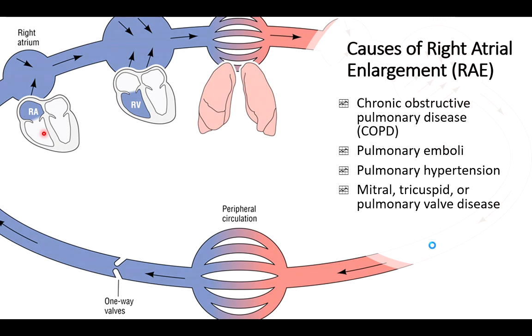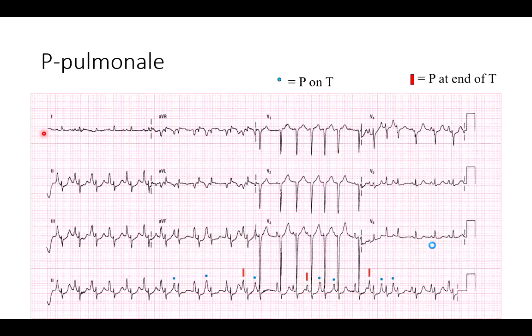So when I see some of these indications, I look and go across the board, how does this ECG look? But then also talking to the patient, right? If I see something, this leads me to ask more questions. I have an indicator on an electrical impulse or electrical activity of the heart. Do I see anything clinically in my patient? Because maybe nothing matches up. Maybe they're asymptomatic. Maybe this is nothing. Maybe it's not a big deal, but maybe it is. Maybe we need to ask those questions.